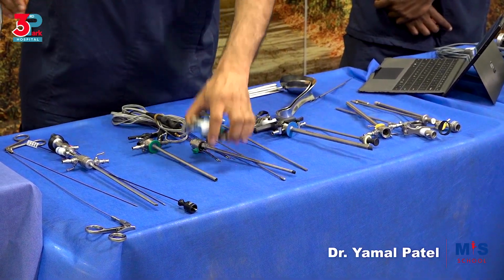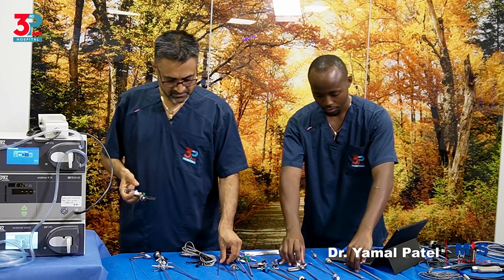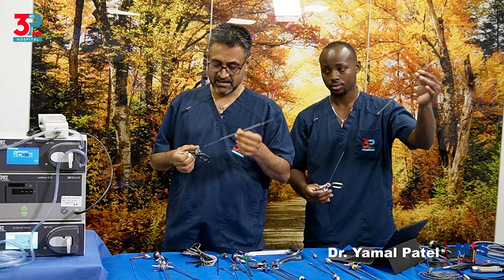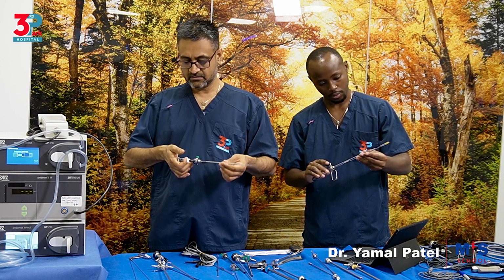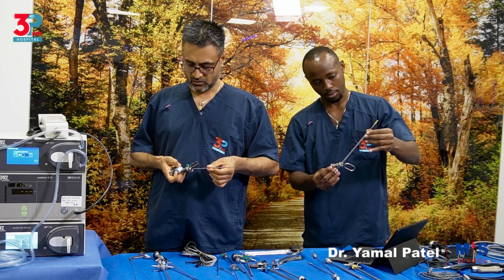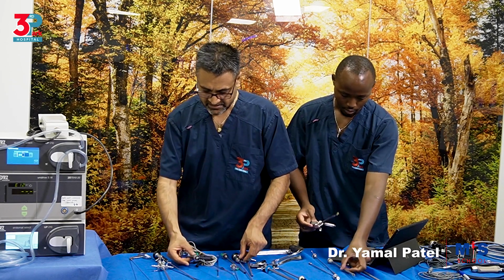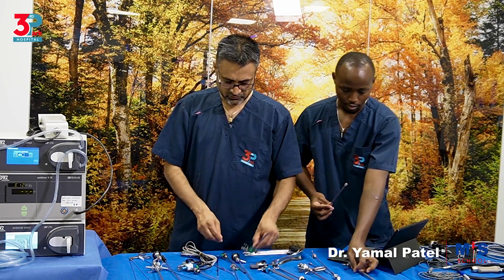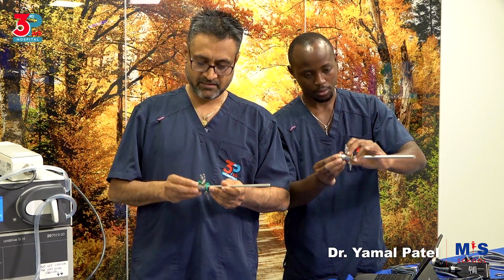How do you assemble a resectoscope? We have the working element. You will take the electrode and connect the working element to the telescope, lock it in. The next thing will be to take the inner sheath and the outer sheath and connect these two and lock them.